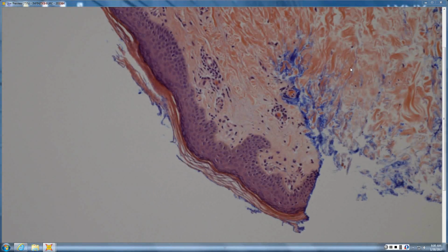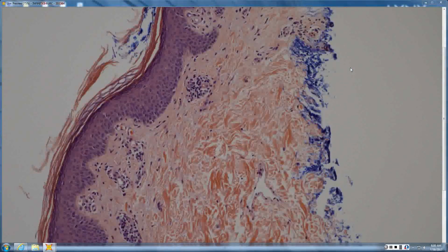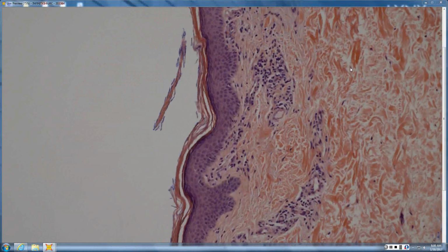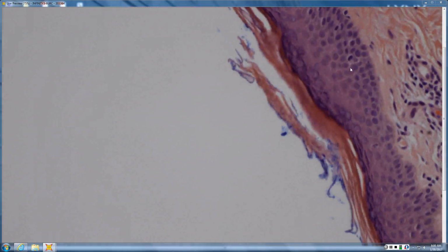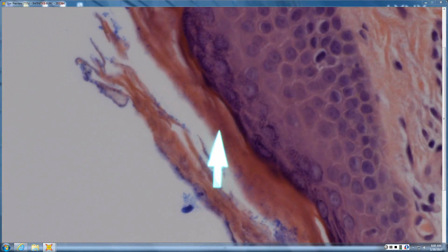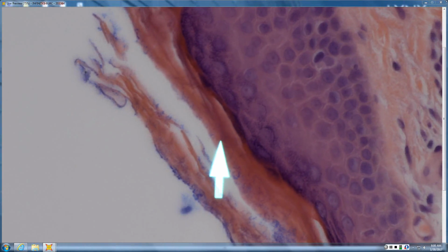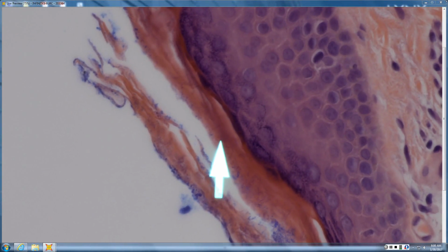Superficial, the collagen was a little wispy, but in the epidermis there's a little bit of, I don't know if it's just marking or actual bacteria. Yeah, so you look at the top to see, the corneum looks like it's broken apart a little bit, right? So let's look, is there something going on in that corneum? Yeah, it looks sort of vertical. So vertical things, and they're not hollow like vertical candida.